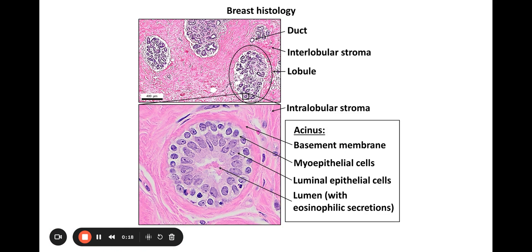So just going through kind of normal breast histology first. Remember, the primary structures to think about are going to be ducts, which you can see here, and you can see lobules here. And then all of this over here is just going to be stroma in between.